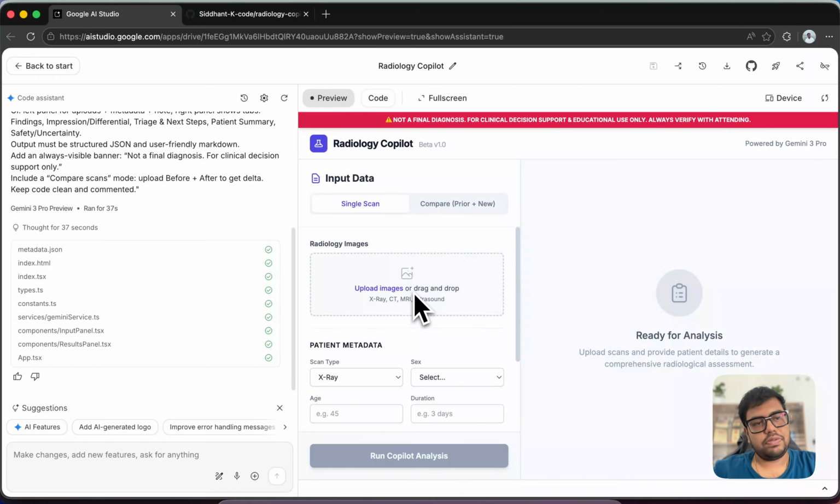Hello, this is a quick video about the project I made using Google AI Studio. I built it for the hackathon, and it's based on my older idea which I was trying to build in my college days. During the COVID outbreak, the idea was how you can detect pneumonia or COVID using X-ray images. At that time, we were using ML models and image extraction with Keras models.